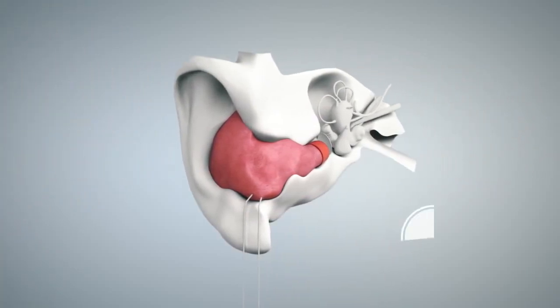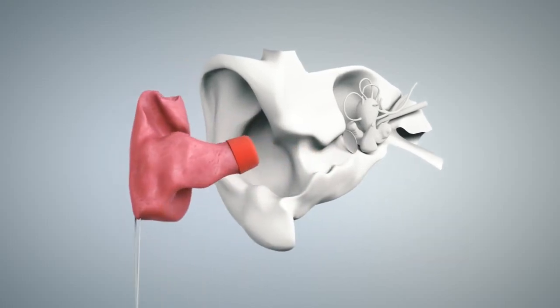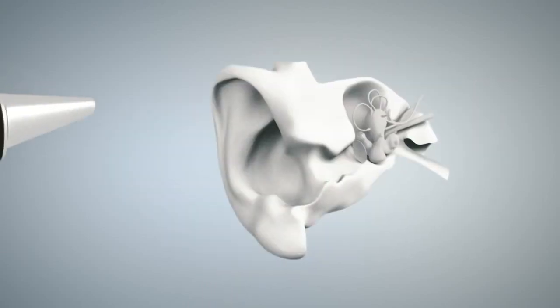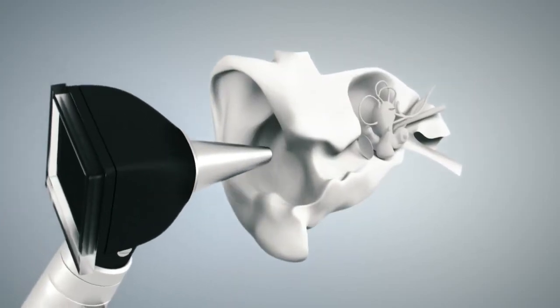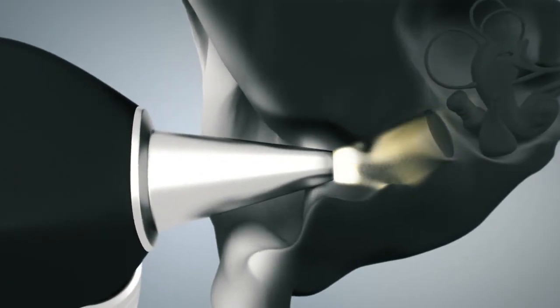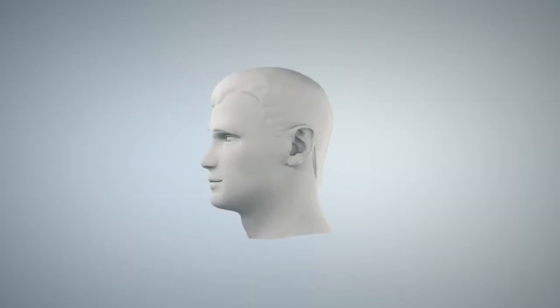Wait for the silicone to harden, then take the impression out of the ear just like any other ear impression. Note how the dome is now part of the ear impression. Don't cut it off. As usual, inspect the ear canal after the impression has been removed. And that's it. No discomfort for the patient and no technical difficulty for you.